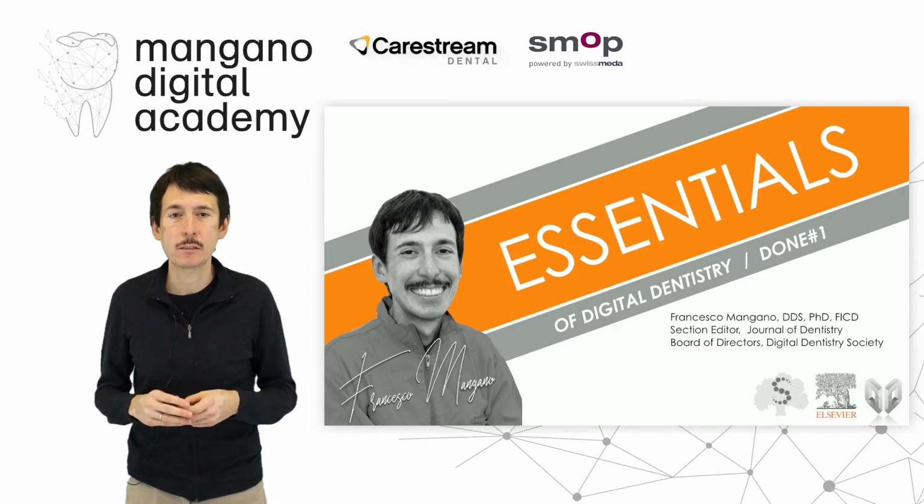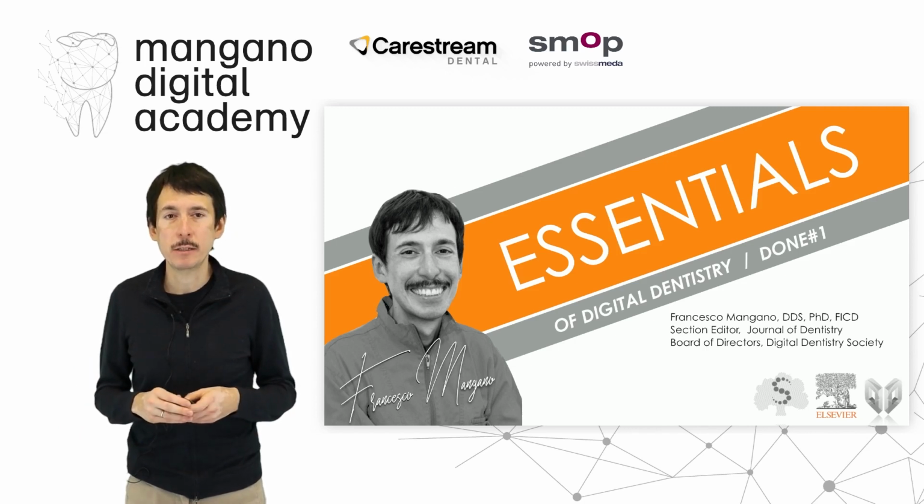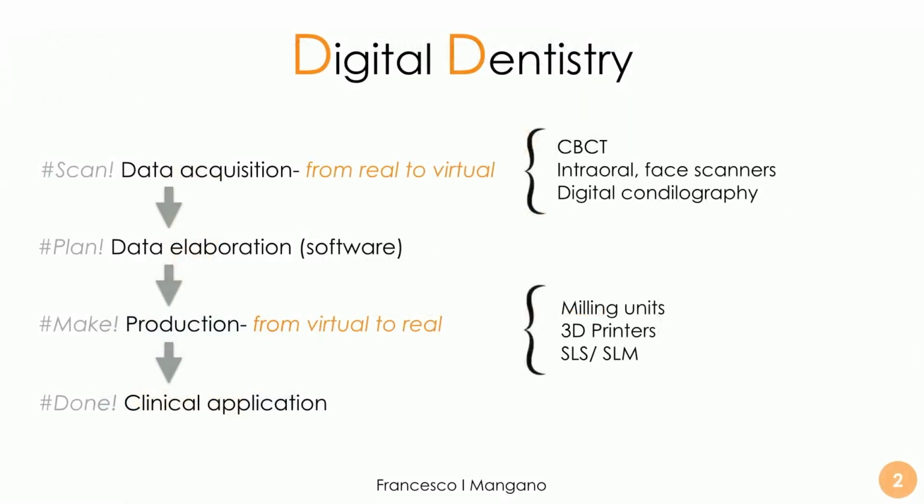of Digital Dentistry. In these last 10 videos, we'll focus on clinical application. Let's go back a little bit on the topic, digital dentistry. We have seen through this a long trip together that digital dentistry is based essentially on 4 steps.